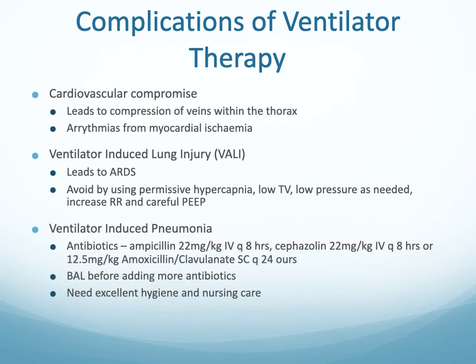Ventilator-induced pneumonia, this is a real thing. When we put our patients on a ventilator, obviously we've got to put them under anaesthetic, but we also are bypassing every single defense mechanism that the respiratory system has for bacterial contamination. So we've got a tube that goes straight into the trachea.